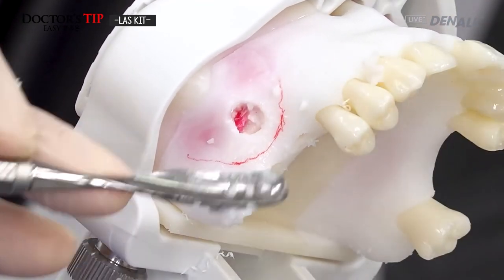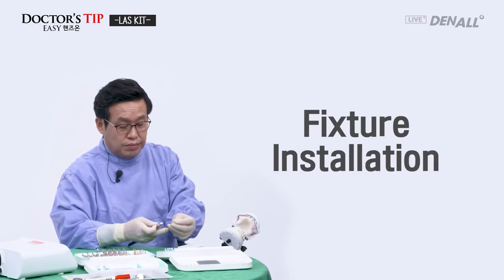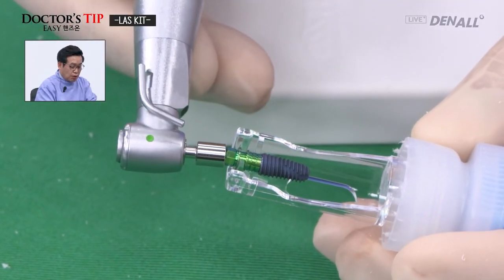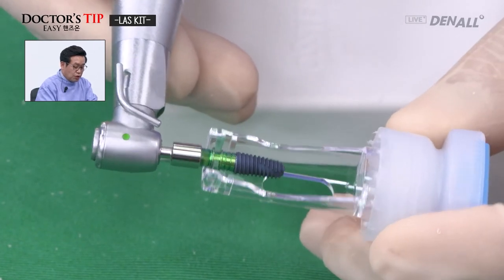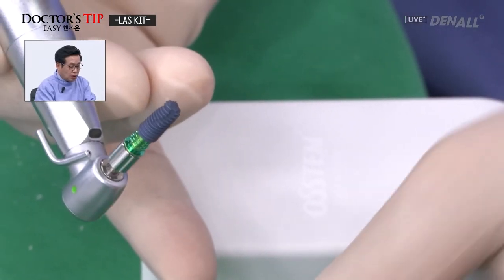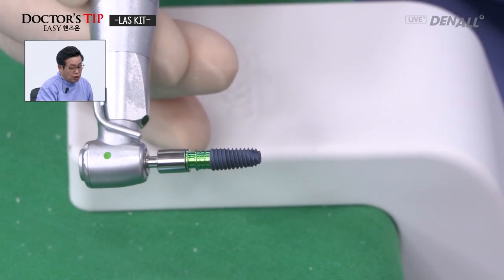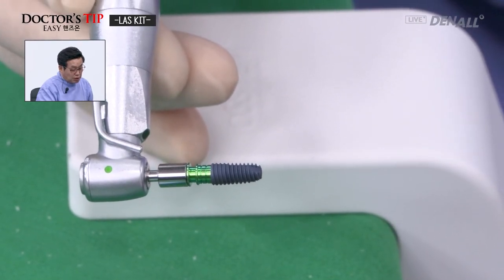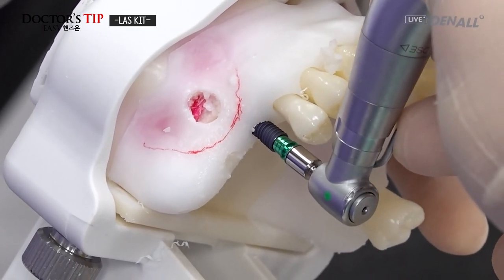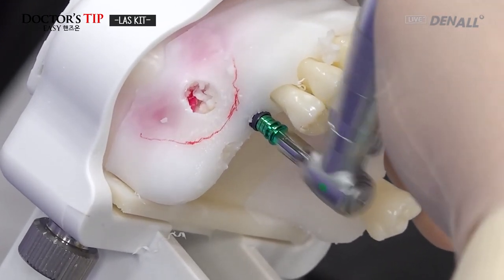Grafting is almost complete. Now, using the mount driver, a TS3 10mm implant of 5.5 diameter will be installed like this. It's placed, and delivering it orally, check that it's in the right mode, and then place the implant. So in the drilled site, like this, you place the implant. I think it's almost done.